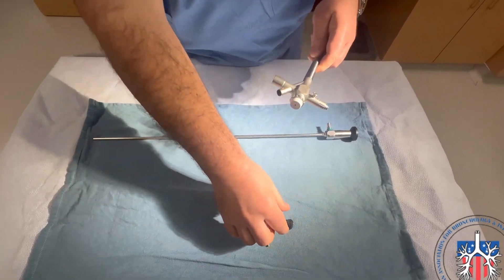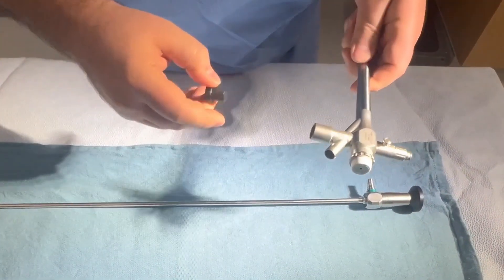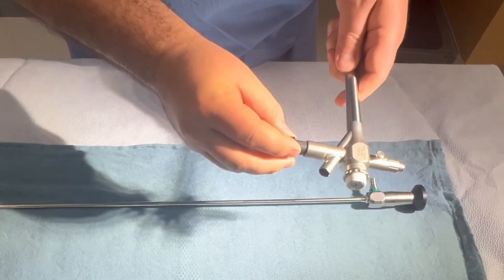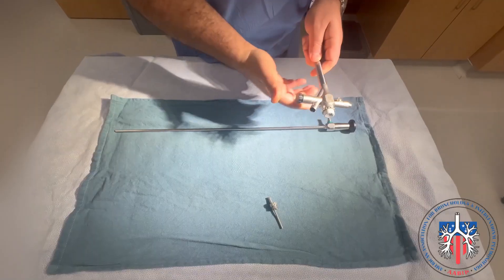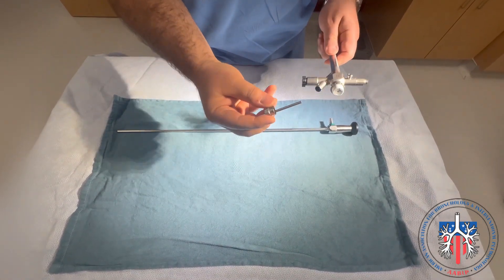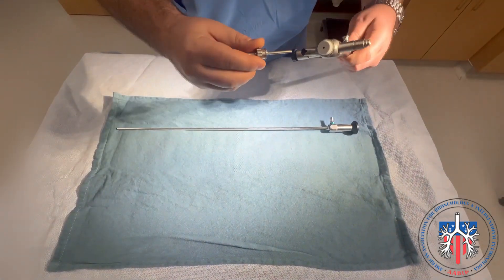If you are using jet ventilation, then the conventional ventilator opening needs to be kept closed to have a closed circuit. The injection cannula for jet ventilation will connect to an open port.